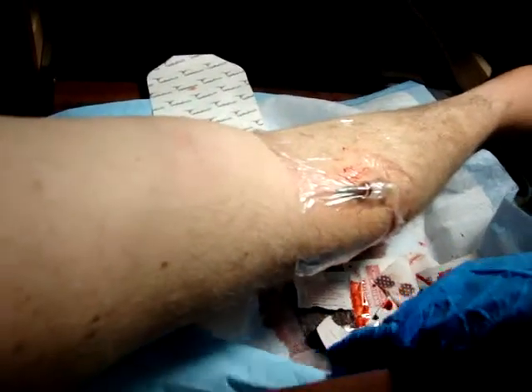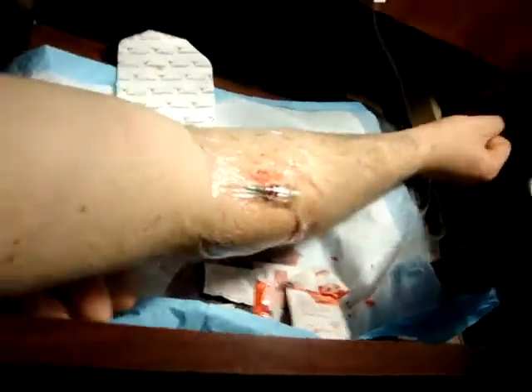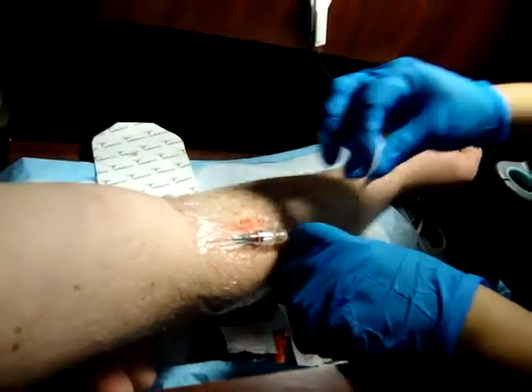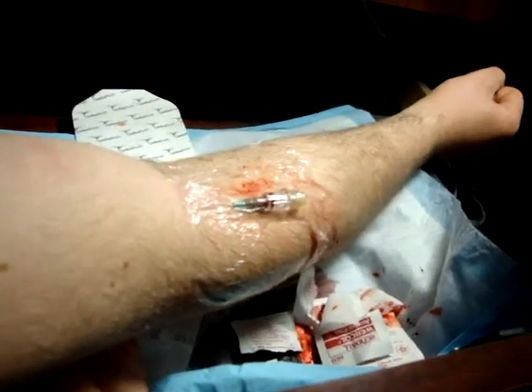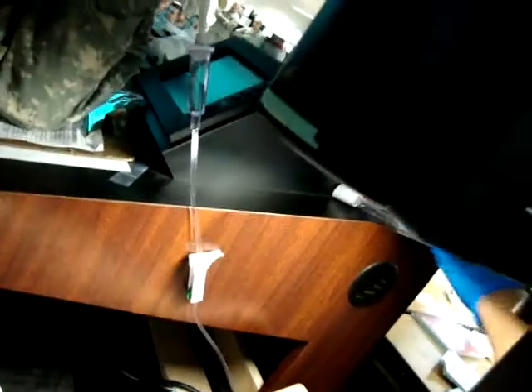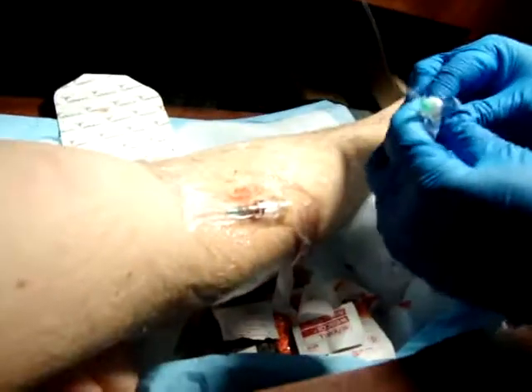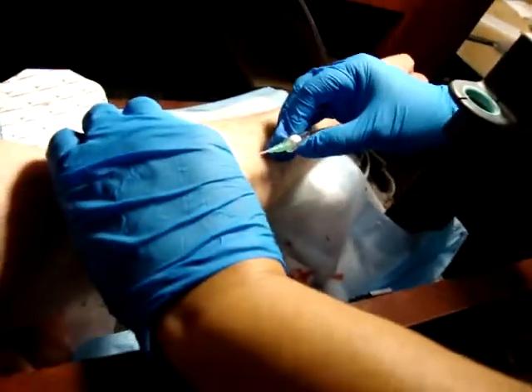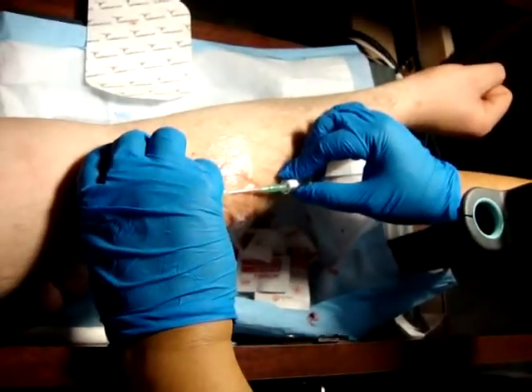Next. This is the last thing you have to do. Take another alcohol pad — that one's not saturated — and clean it again. It's all about sterilization, people. Grab your last catheter, take it off, look at it, make sure there's nothing going on with it. Maintain positive control over your saline lock and push it all the way in.